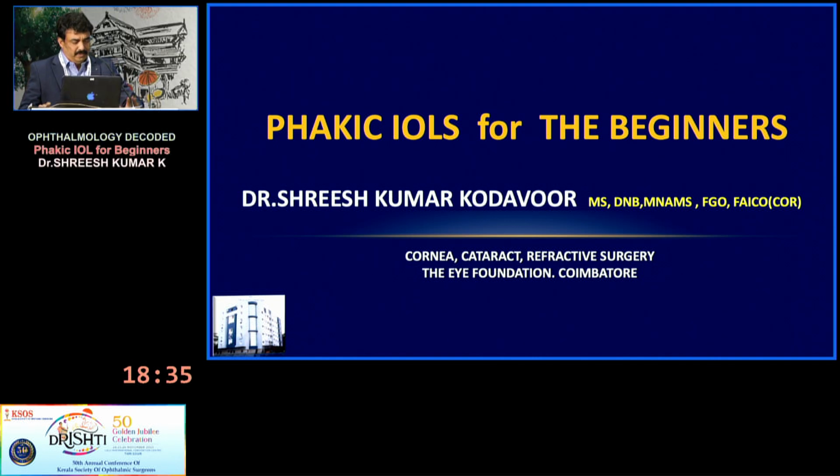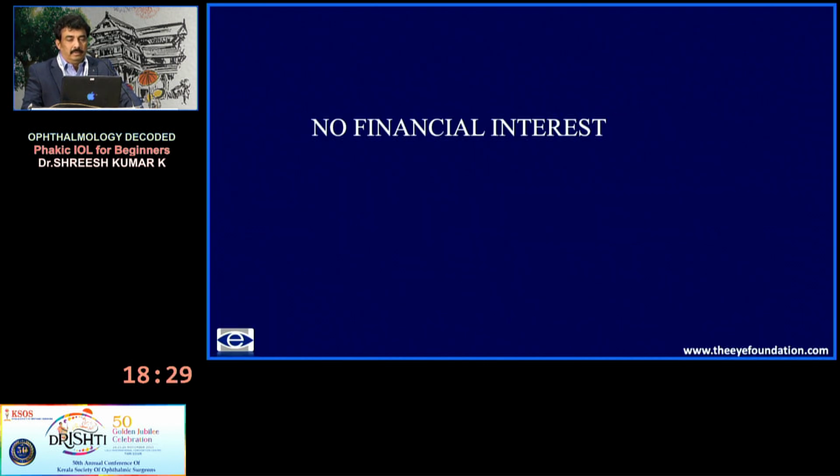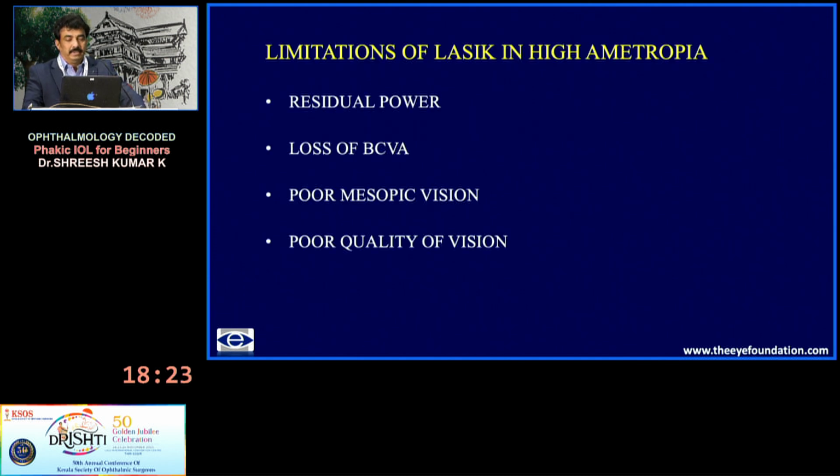Good morning. My topic is phakic IOL for beginners. I don't have any financial interest in the topic or the products I mention here. The goal of any phakic IOL surgery or any refractive surgery is to provide emmetropia without possible change of refraction in the long follow-up.